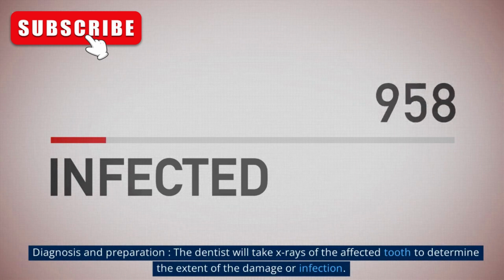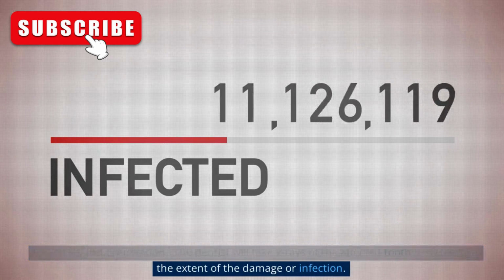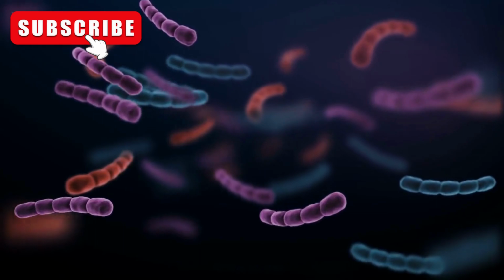Diagnosis and preparation. The dentist will take X-rays of the affected tooth to determine the extent of the damage or infection. They will then numb the area around the tooth to make the procedure more comfortable for the patient.